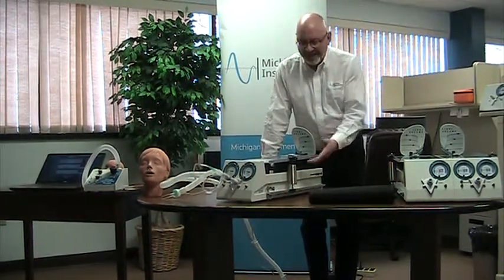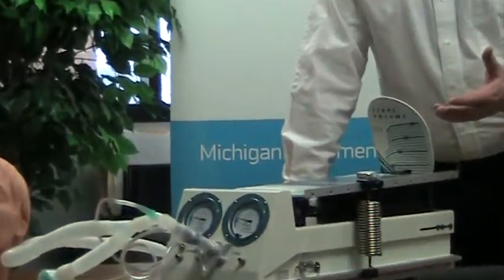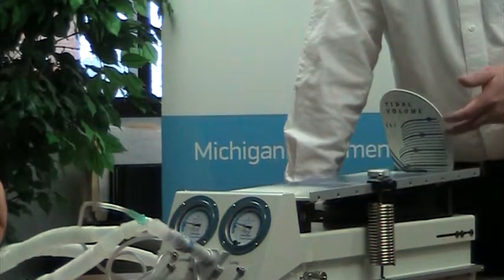All of our units incorporate a lung bellows that expands when filled with gas. That expansion is measured on the scale on the back of the unit. We have a volume scale here.